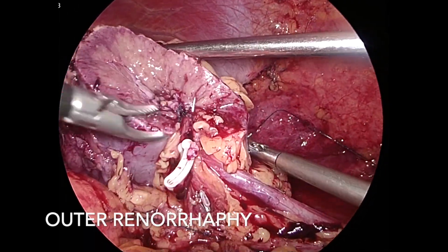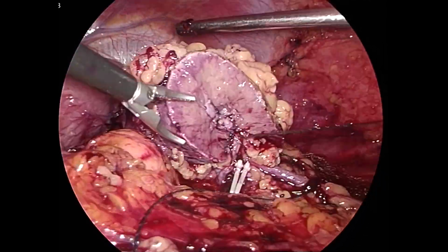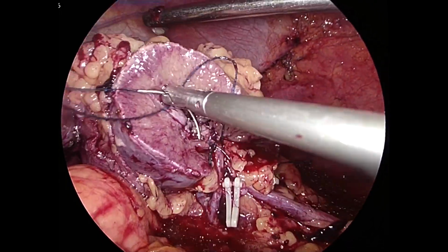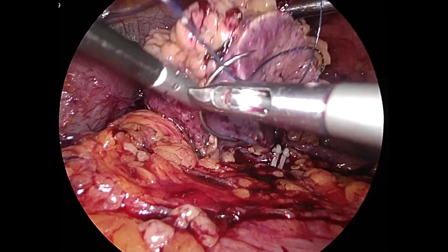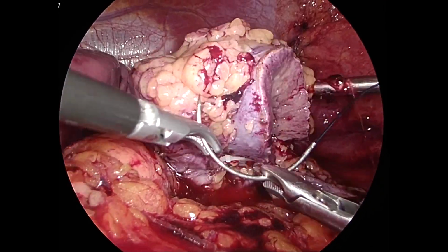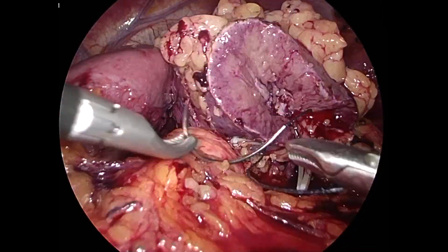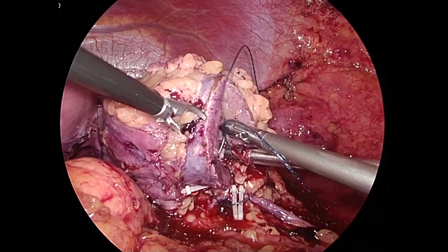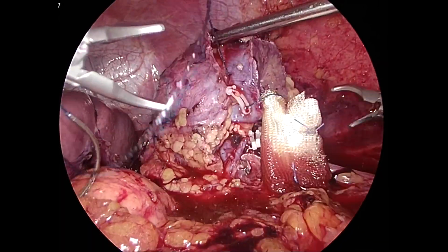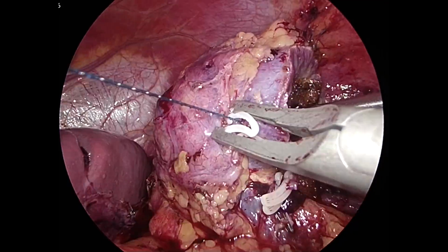Outer renorrhaphy was done using a 2-0 V-Loc suture in a continuous manner. A plate made of Surgicel and Abgel was placed during outer renorrhaphy to ensure better hemostasis.